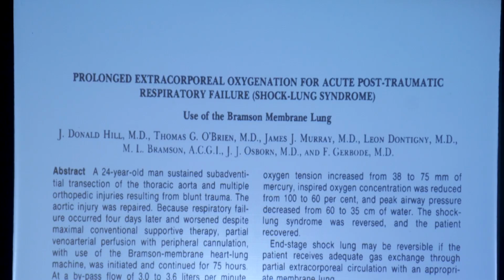All right. So let's talk about why would we use ECMO in respiratory failure. The first published report goes as far back as 1972 in California, and this was a trauma patient who, you can see the abstract here from the New England Journal of Medicine, a 24-year-old with a transection of the aorta and multiple orthopedic injuries, who had surgery to fix the transected aorta, had surgery for orthopedics, but was developing worsening respiratory failure in the ICU.